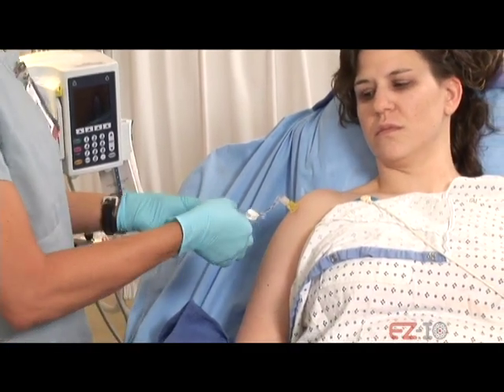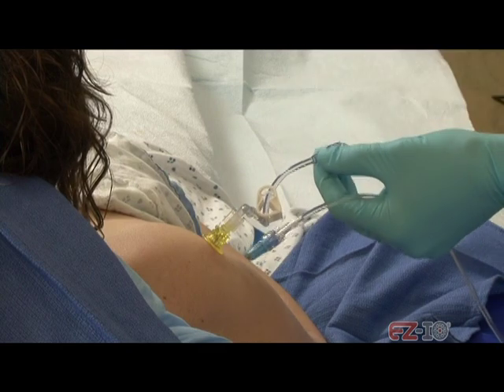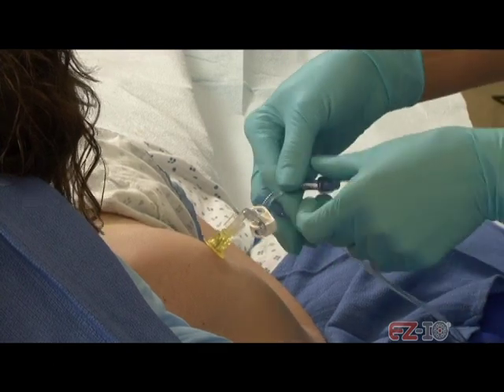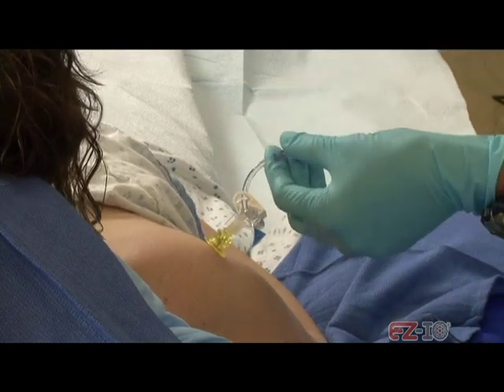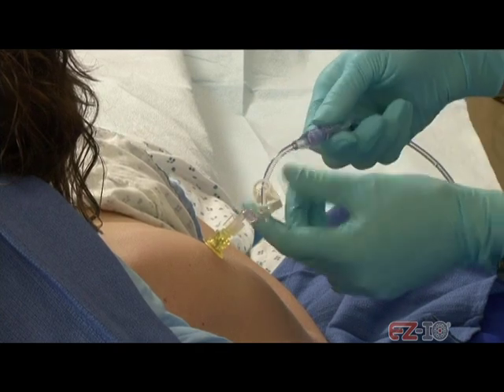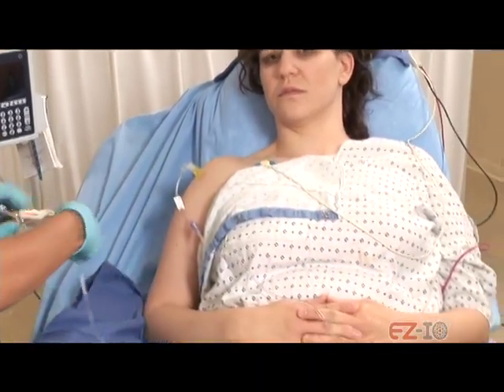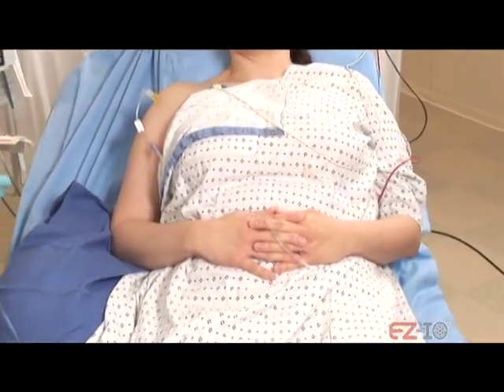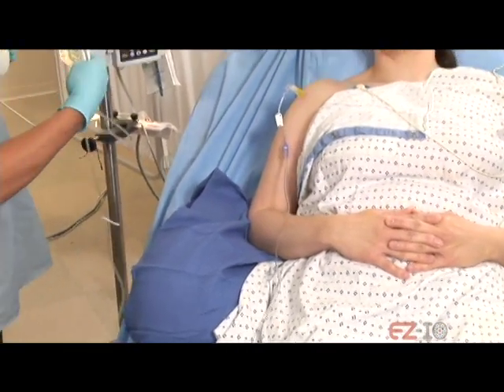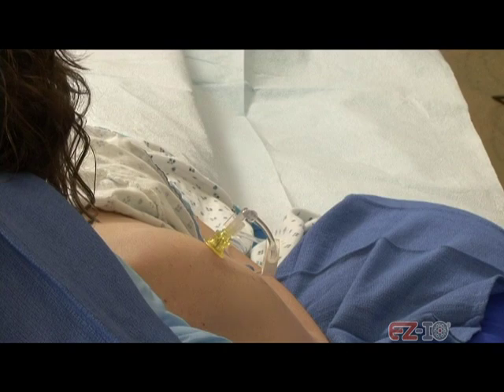The pressure in the medullary space is approximately 1/3 of the patient's mean arterial pressure. This is important to remember because the pressure outside the bone in the IV bag must be higher than the pressure inside the bone to achieve flow. Therefore, fluids or medications must be delivered under pressure to obtain maximum flow rates. Rapid fluid infusers can be used for aggressive fluid resuscitation. I'm just putting a little pressure on that fluid.